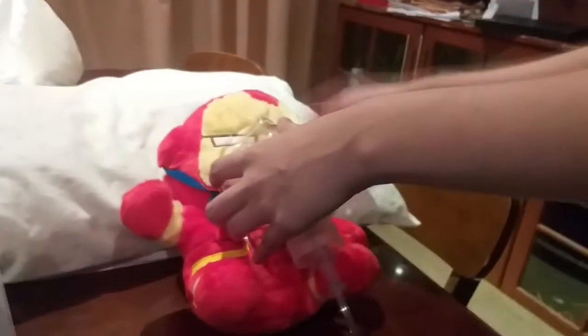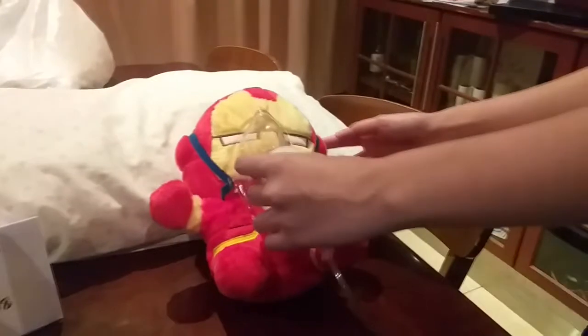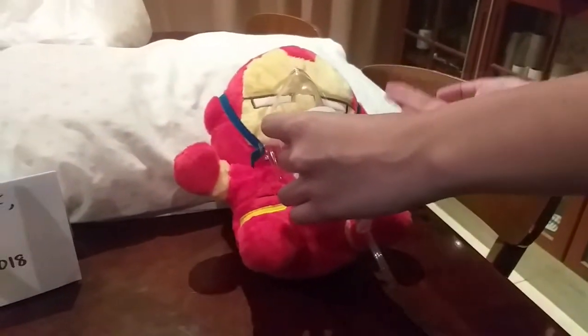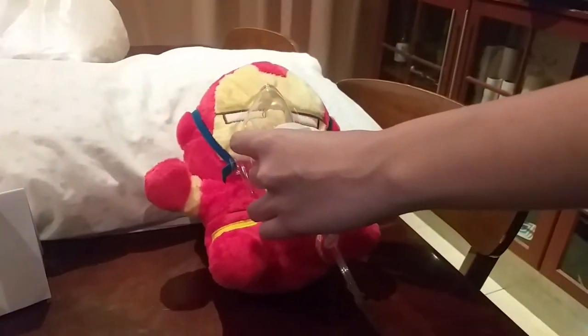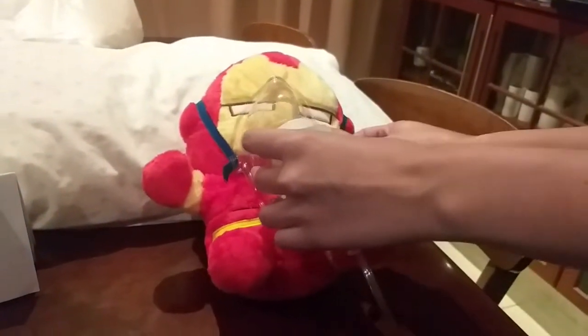I will be adjusting the elastic headband or plastic slide on the cannula or face mask so that a snug, comfortable fit is achieved. And this directs the flow of oxygen into the patient's upper respiratory tract, and the patient is more likely to keep the device in place if it fits comfortably. So, there, I've adjusted it.